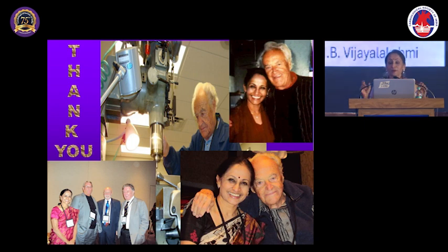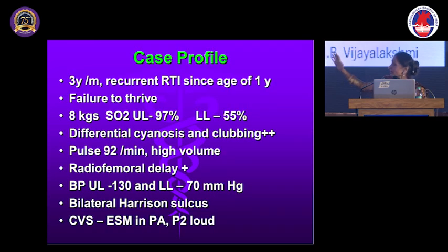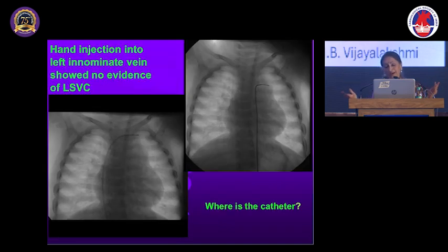Okay. Now I have used the Berman catheter, inflated the balloon without allowing the dye to come back, and now what do you see? Scimitar sign. That is a scimitar. So you have to use the Berman catheter to get a good angio, and that is the scimitar. The MRI, they say, is better, but cath is no less. Literally, you can show the whole scimitar where it is draining. So that is the scimitar syndrome.